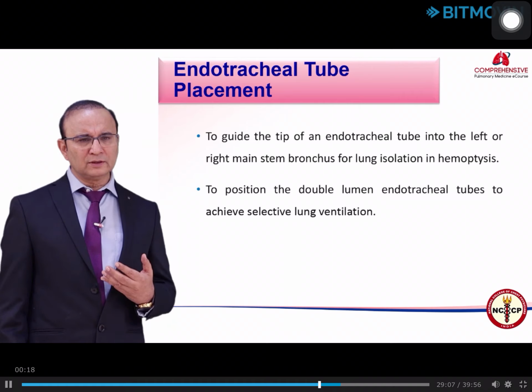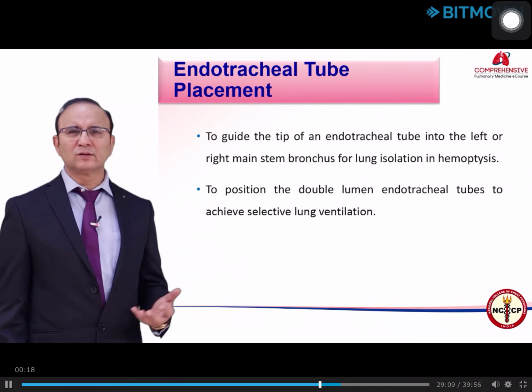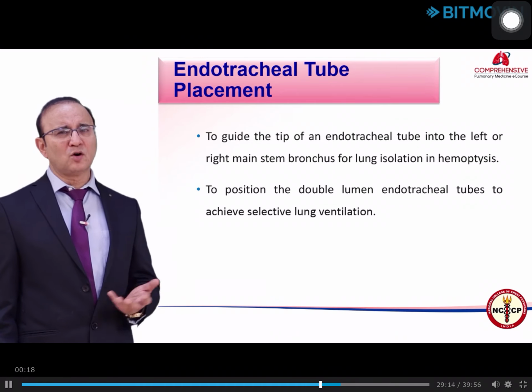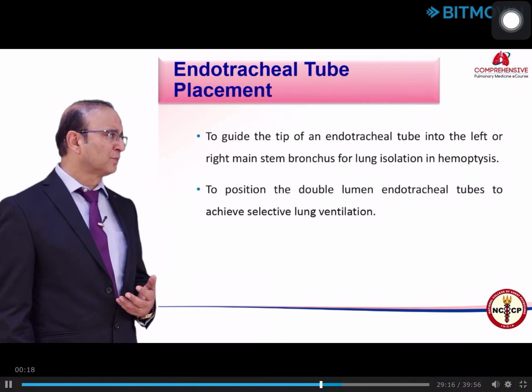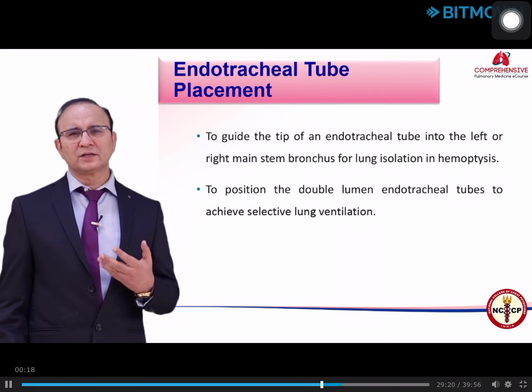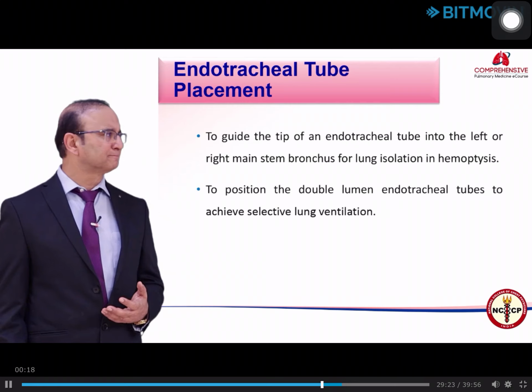Then when you have to put in a double lumen tube, the fiber optic bronchoscope is very commonly used by anesthesiologists to position the double lumen endotracheal tubes and to achieve selective lung ventilation.